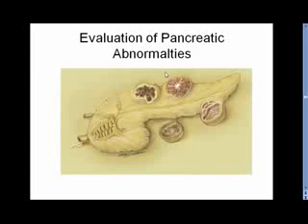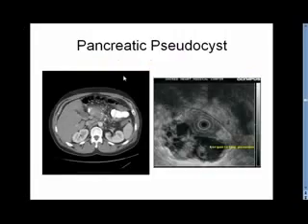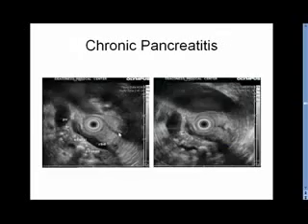Now there are lots of other pancreatic abnormalities which can be evaluated by endoscopic ultrasound, chief of them, pancreatic pseudocyst. This was a patient who did have some pancreatic calcifications and an ill-defined mass on CT scan, which was hard to further characterize. This is it, and here on endoscopic ultrasound it becomes quite clear what this is: an organizing pseudocyst with lots of debris and septations inside. This particular patient also had a small duodenal pseudocyst, not shown.